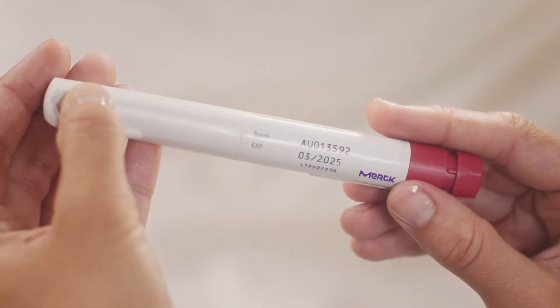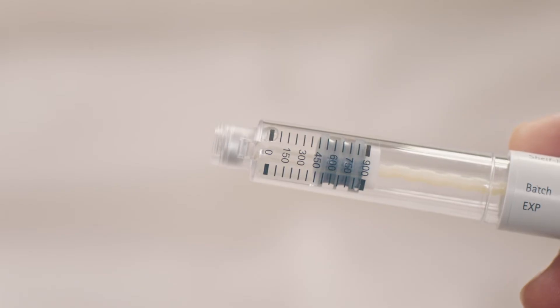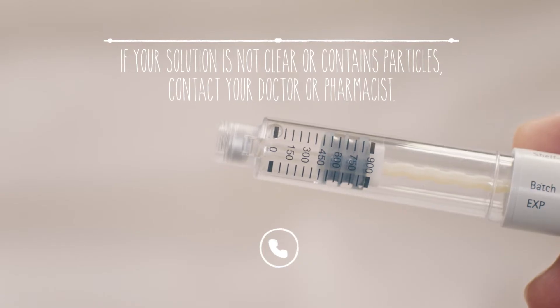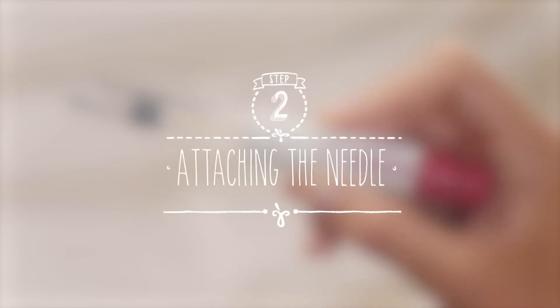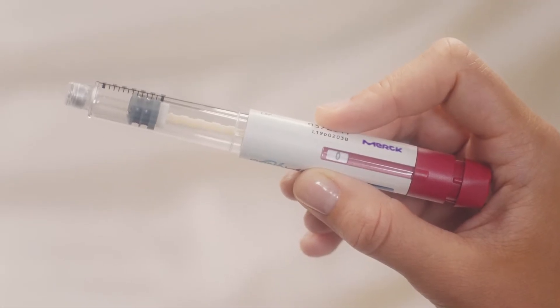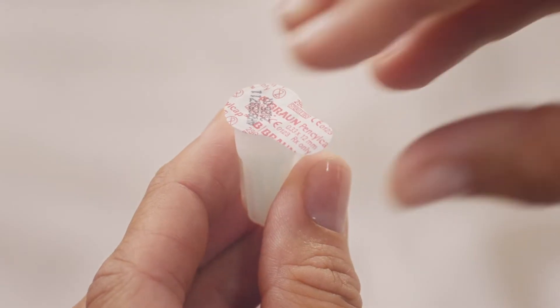Before you use the pen, make sure you check the expiry date. First, take off the pen cap and take a close look at the solution in the drug reservoir. The solution should be clear with no particles in it. You must not use it if it isn't clear, or if it contains particles. OK, so mine looks fine. Before attaching the needle, first check that the dose is at zero, and check that the seal on the outer needle cap is intact. If it's damaged or loose, you should dispose of this needle and use a new one.